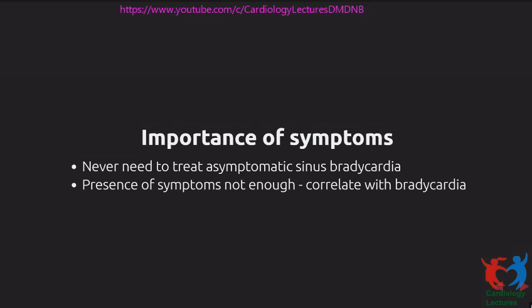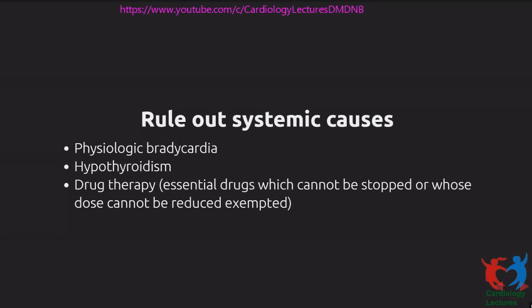The way you would correlate is if you put on a Holter and the patient tells you that he had the symptoms reproduced at 4:30 p.m. and you see that at 4:30 p.m. the heart rate fell to below 40 and you're sure that caused the symptoms, then you have correlation. So when you have correlation, it's a class 1 indication.